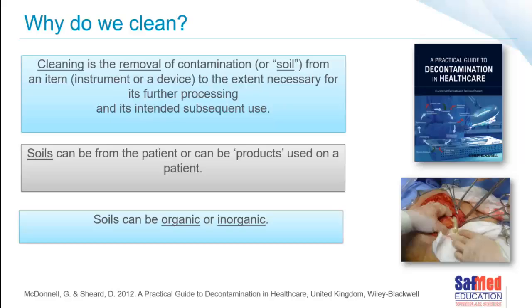Of course, why do we clean? The definition of cleaning: removing of contamination or soil from an item, an instrument, or a device to the extent necessary for its further processing or its intended subsequent use. So we need to get it as clean as necessary for the next step in the process.